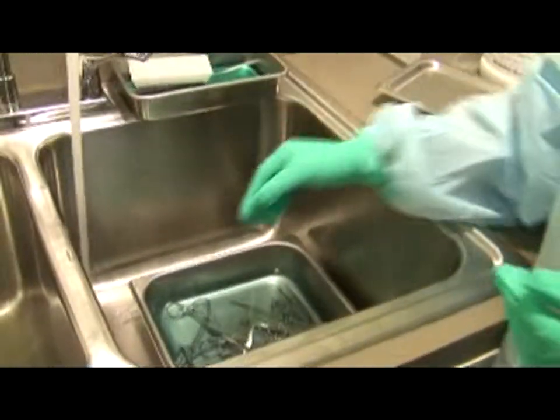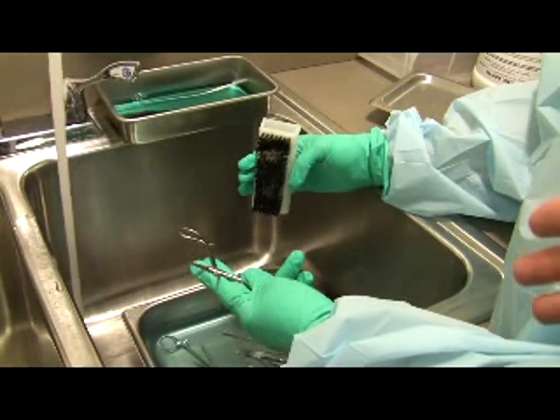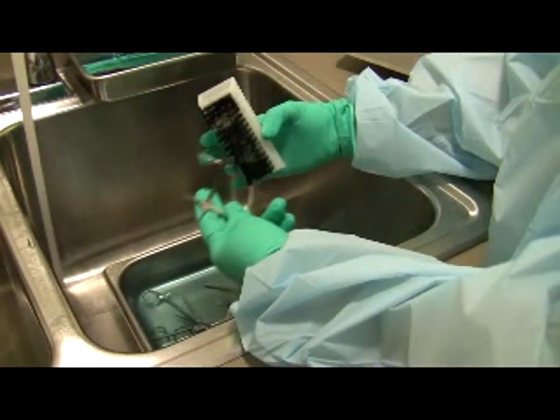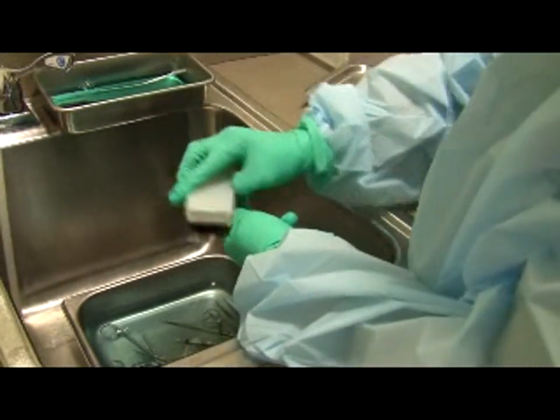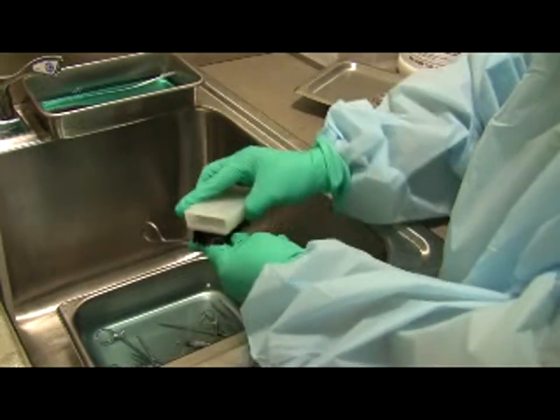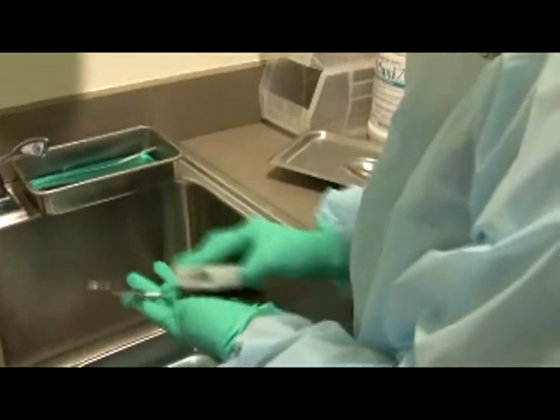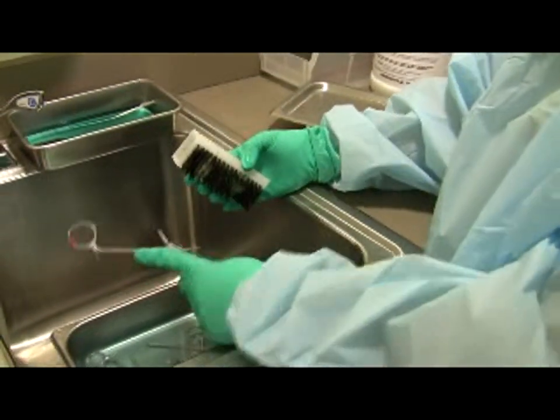Carefully extract each instrument one by one. While you can use gloved hands, consider using tongs to remove each instrument and then clean it individually — especially if there are many scissors jutting out. Once you have an instrument, take one of the brushes — the nylon one — and just scrub. A good approach is to do all hinged instruments first, then move on to the others.